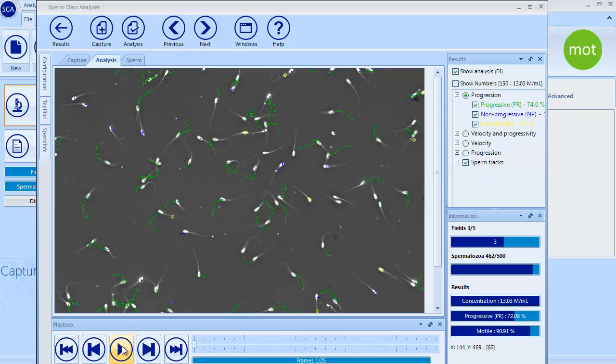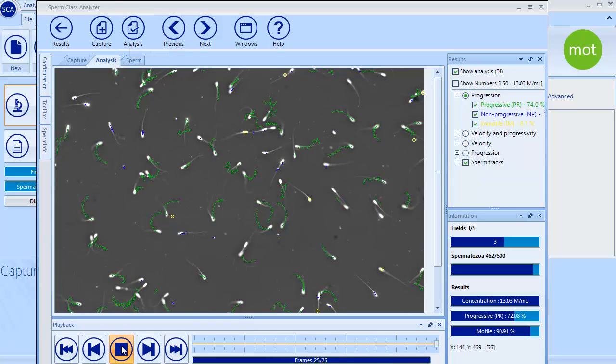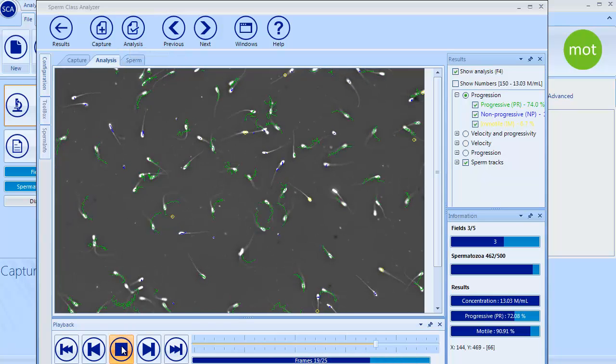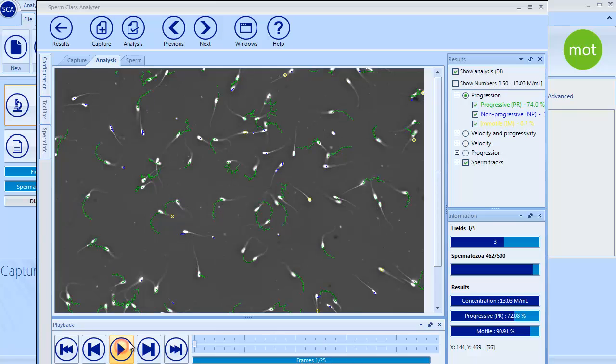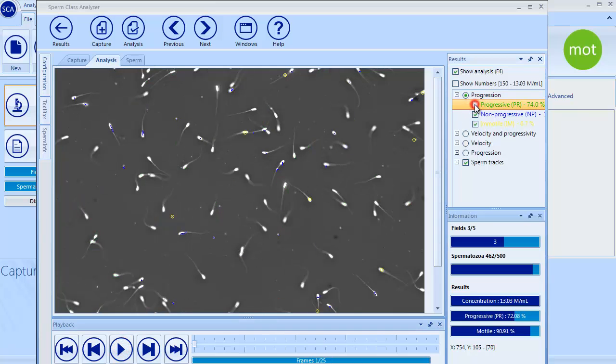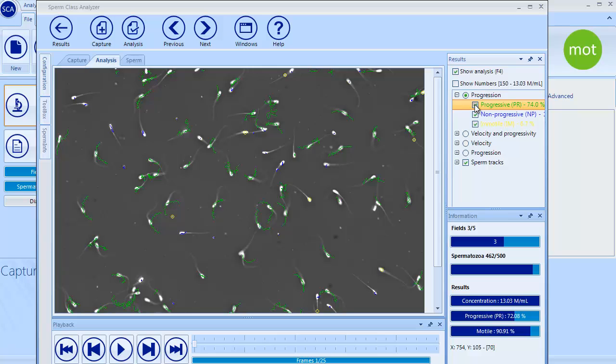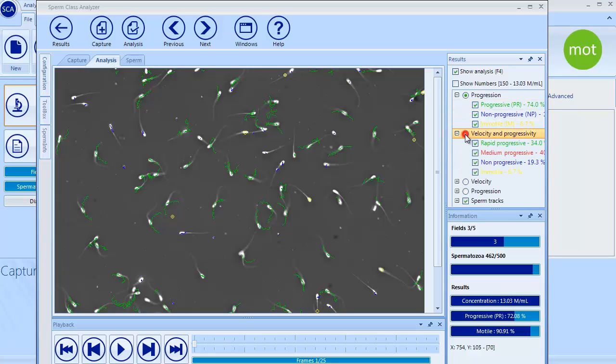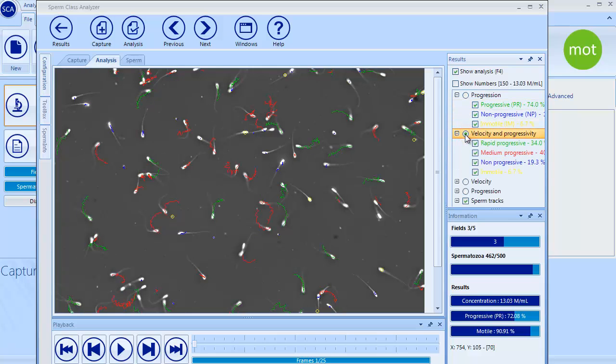All captured sequences can be played in the Analysis User tab. Using Results menu, user can choose different sperm classifications and mark or unmark which spermatozoa are displayed.